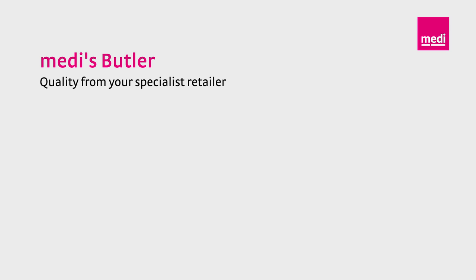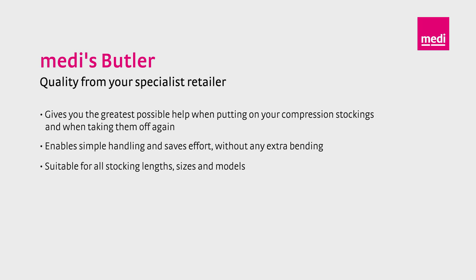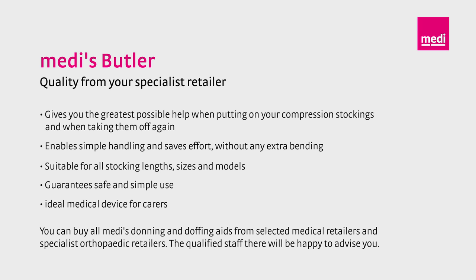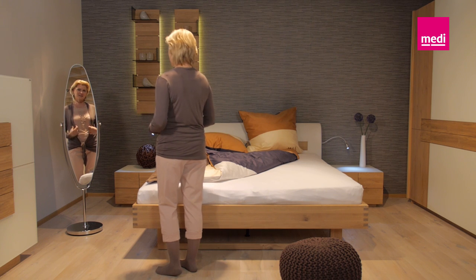The Medi-Butler gives you the greatest possible support when putting your compression stockings on and taking them off. It enables simple handling and saves effort without any extra bending. The Medi-Butler is suitable for all stocking lengths, sizes and models and guarantees safe and simple use. It is also an ideal medical device for all carers. Putting on compression garments is really simple with Medi's butlers. They help you to start the day with your fashionable compression stockings.